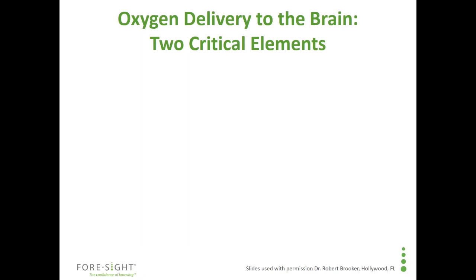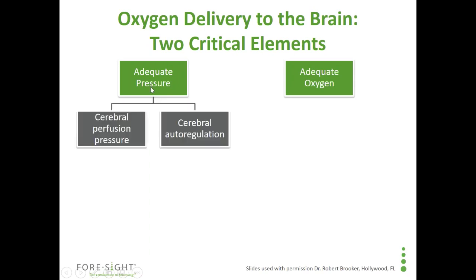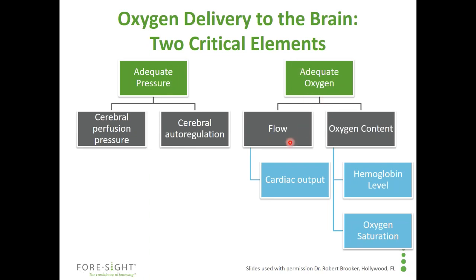All right, so to go further into detail relative to the question of the oximeter, this is all review for your audience, but it's important to think about it because it supports the idea of using an oximeter and highlights the idea of using one that has good accuracy. So relative to oxygen delivery to the brain, there are two primary drivers. You've got the cerebral perfusion pressure, and then you've got the whole issue of oxygen delivery to the brain. And the oxygen delivery obviously is going to be governed by cardiac output and your oxygen content. So these are the core components that are going to determine during your operation oxygen delivery to the brain.